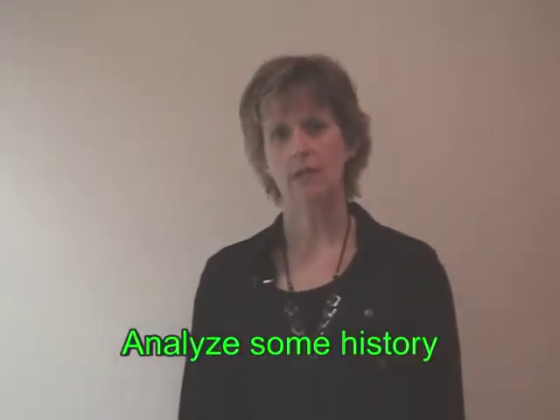Then it's very, very important to talk with your patients and analyze some history. Why did they go see the doctor? What were their symptoms? Are they having pain on one side or the other? Because normally you take a PA projection and a lateral projection. Routinely it's a PA and left lateral, unless there is history of pain or a tumor, pneumonia, something that involves the right lung.